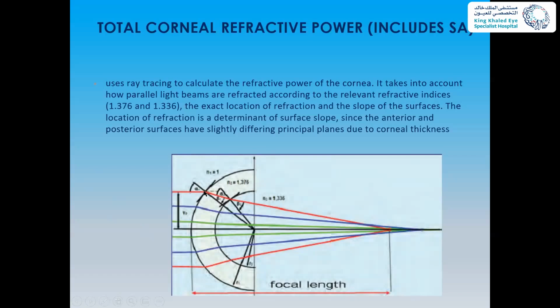Once the ray goes into the cornea, there is even a tiny angle here which Snell's law does not account for. Then when it comes out, there is a tiny angle here too. Let us use a bigger image. The rays going through the center go straight; the more peripheral they go, the more they have to bend.